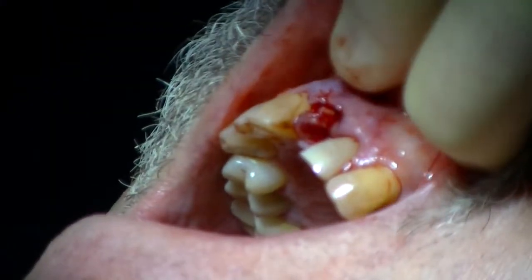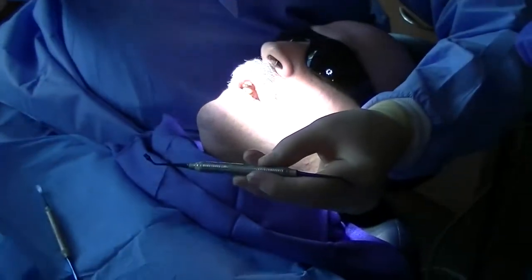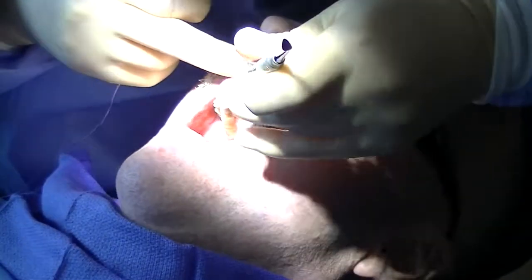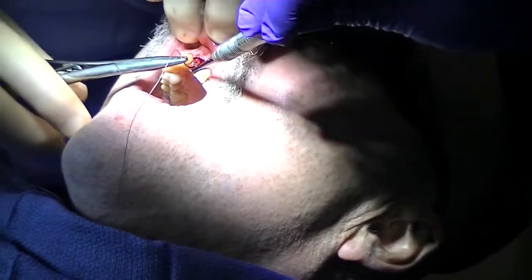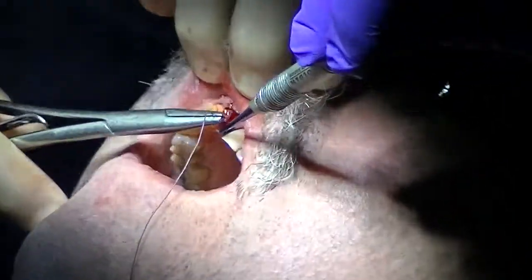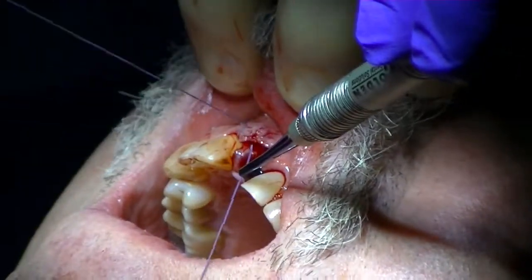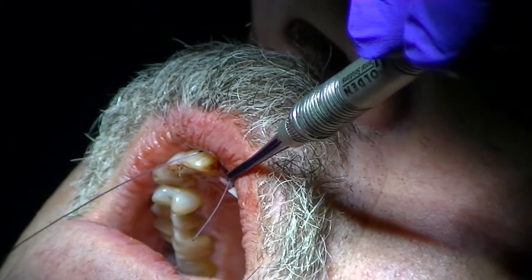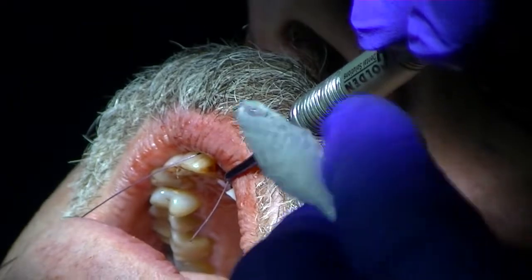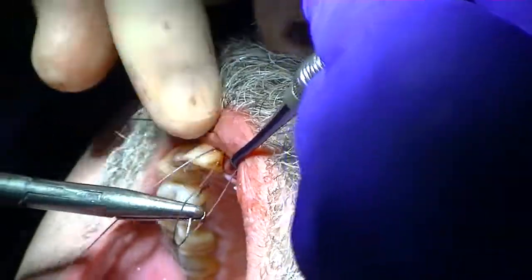Everything that we've learned. Take an instrument that has a little flat area on it. Initially, so you don't grab onto it, if she can just hold it like that. As we talked about before, we go from crestal to facial. Then I'll simply turn the needle around, my reverse cutting needle, and go, you can let go now.